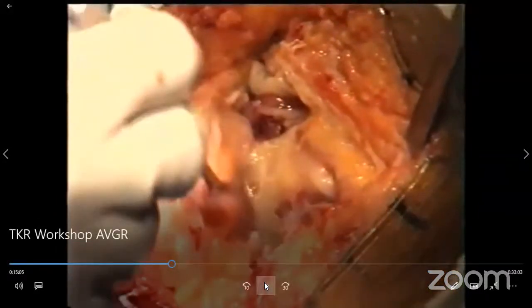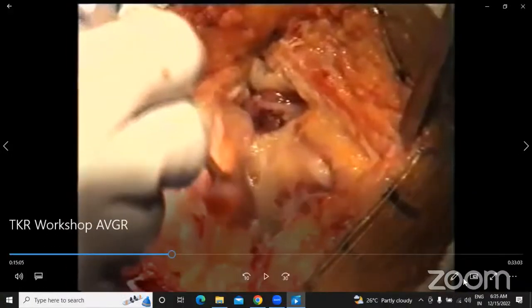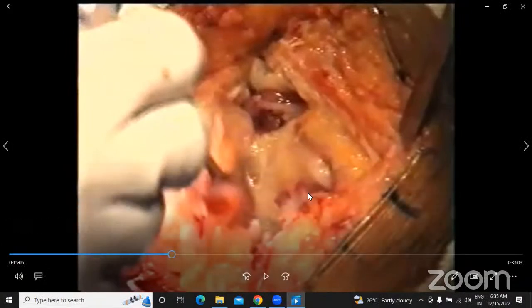Yeah, so this point is very important. At the tibial tuberosity, when you start off, the tendency is to go near the tuberosity and not leave any cuff of tissue. But if you do that, then your closure becomes very difficult. So as you're getting the skin incision down into that area, leave at least a centimeter of synovium or tissue beyond the tuberosity so that it aids in closure later.